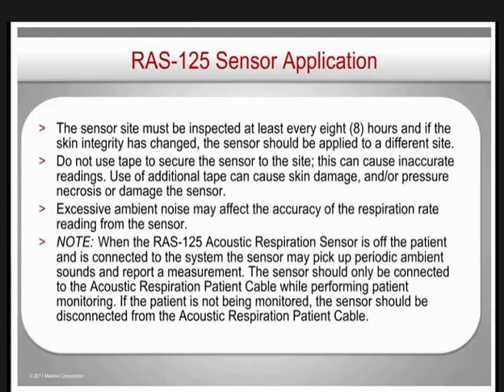The sensor site must be checked at least every 8 hours to ensure adequate adhesion and skin integrity. Do not use tape to secure the sensor to the site. This can cause inaccurate readings. Use of additional tape can cause skin damage and/or pressure necrosis or damage the sensor.